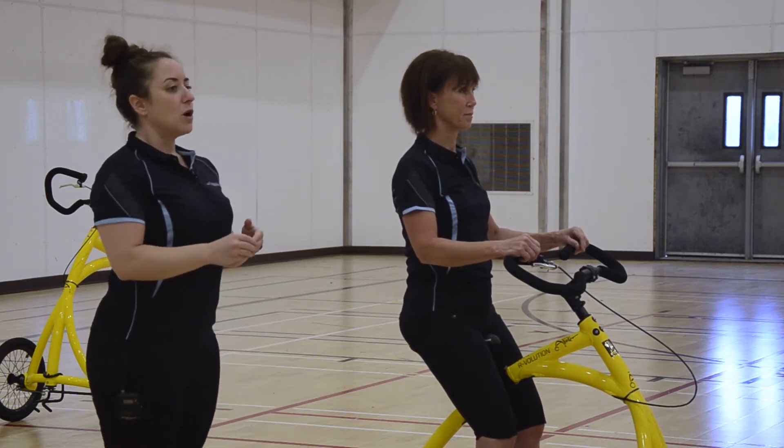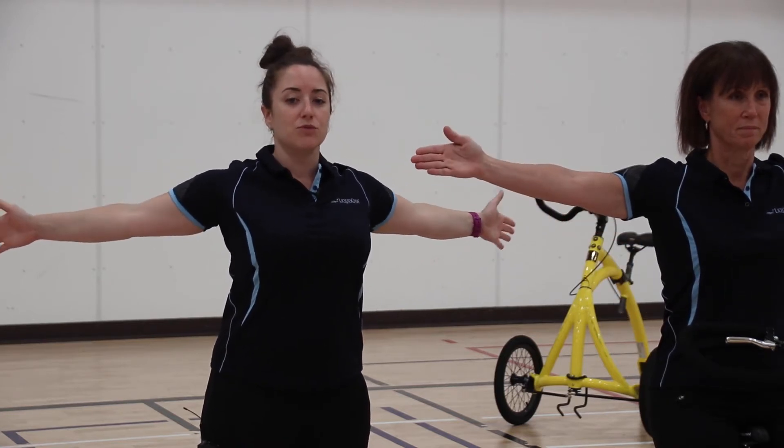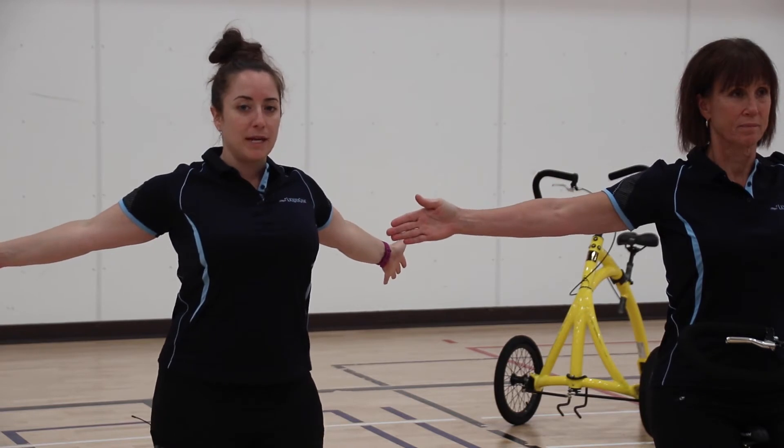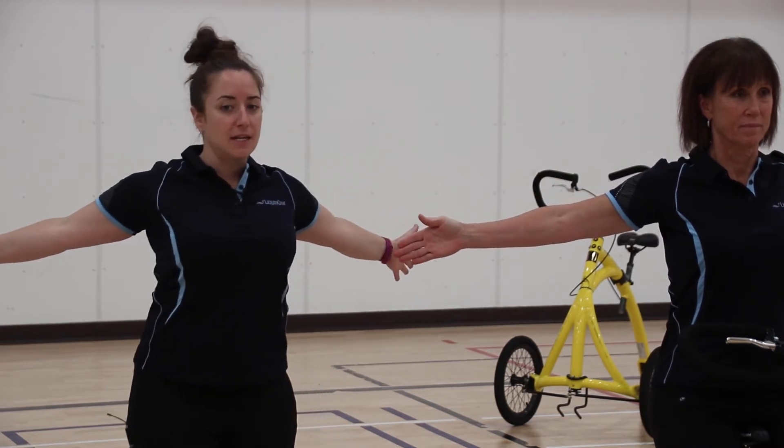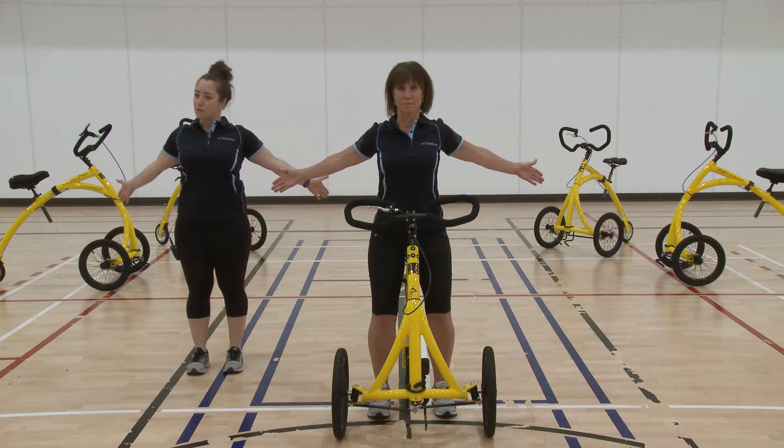You're going to extend your arms out to the side of your body, palms facing forward, and then reach your arms back, opening up your chest as much as you can. You can change the angle of your arms to get a different pull, whatever you feel most comfortable.